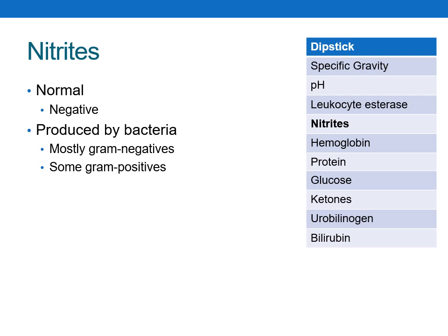This test is highly specific but not as sensitive, meaning that it can definitely determine the presence of bacteria in the urine. However, if the test happens to be negative, it does not necessarily rule out an infection or a UTI.